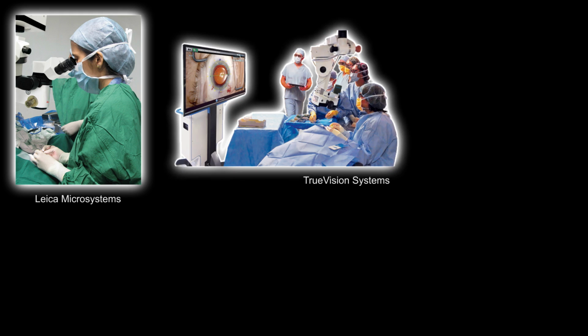For decades, the surgical microscope has been the standard in visualization for ophthalmology. While effective in providing a crisp visualization, the microscope affords only a limited field of view and tethers the surgeon's head to the microscope. This is beginning to change, however, with the introduction of new technologies into the operating room, such as the 3D TV shown here.